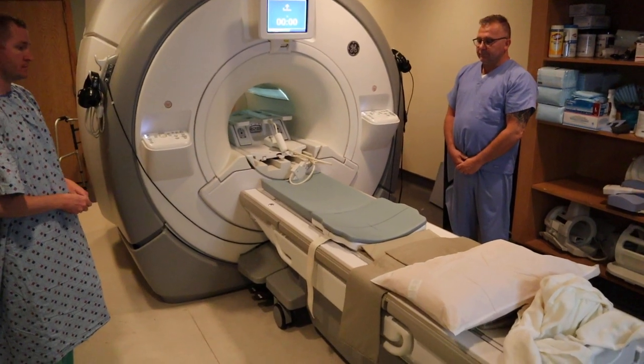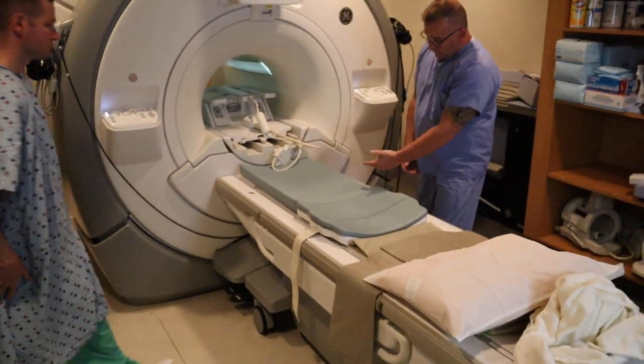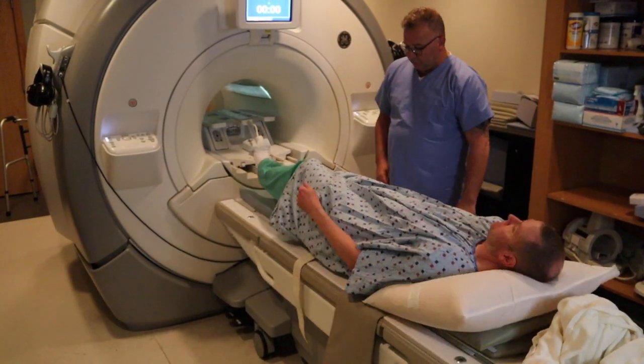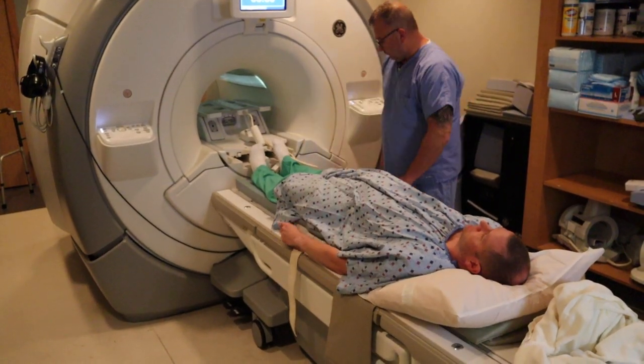We're now going to position for a hip study. We're going to be using the 8-channel coil, which has a posterior and anterior piece. This positioning can be used for a hip, bony pelvis, male or female pelvis, sports injury, or anything related to the pelvis.